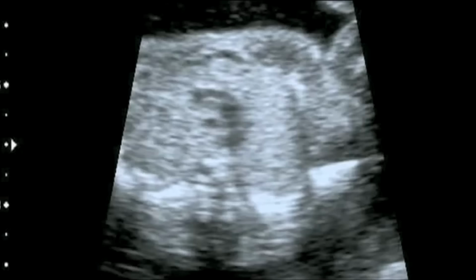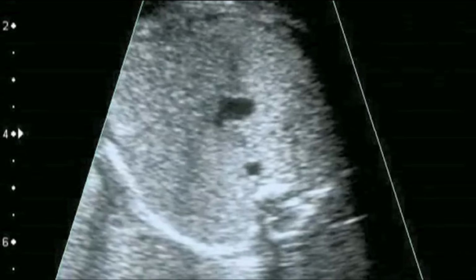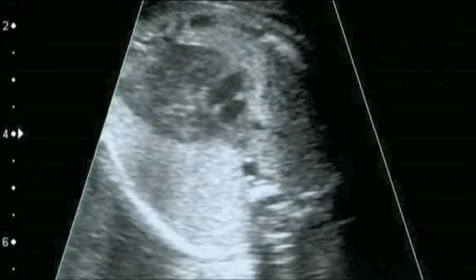There now follows a clip demonstrating all the views in sequence. Starting below the diaphragm and entering the chest to see the four chamber view. The aorta is seen crossing from left to right, the pulmonary valve, the right branch of pulmonary, and finally the aortic arch joining the descending aorta.